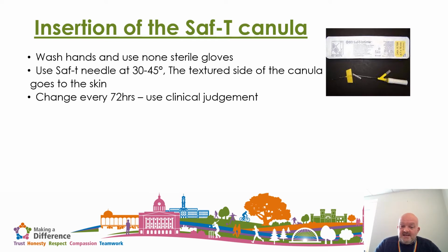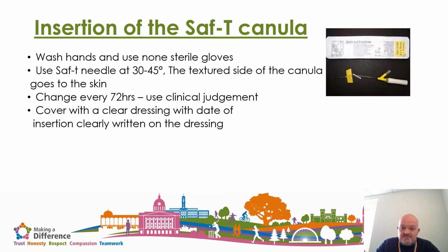In our policy, it states that the cannula should be changed every 72 hours. But as long as we can maintain the fact that the driver's running to time, there's no sign of redness, there's no pain, there's no hardness around the site, then we can try and maintain that site for as long as possible. Once we put the cannula in, we're going to cover it with a clear dressing, and it's good practice to write the date of insertion on that dressing so that the next person who comes along can see when that cannula was inserted.